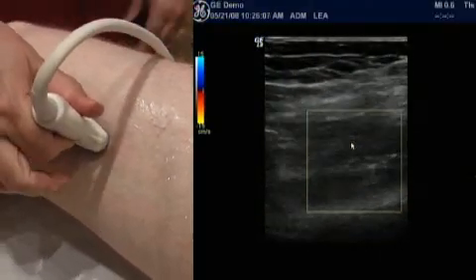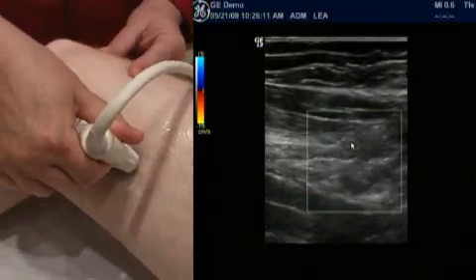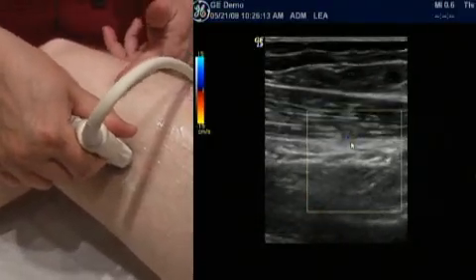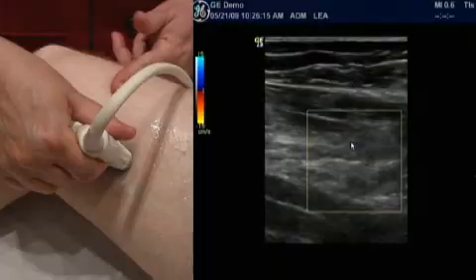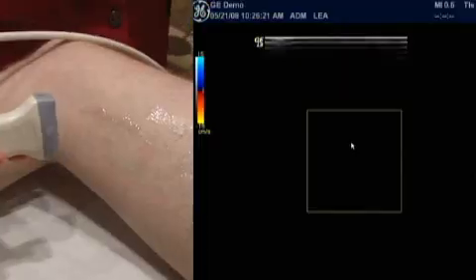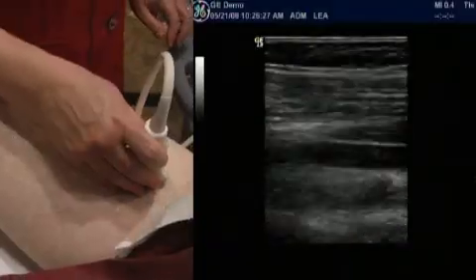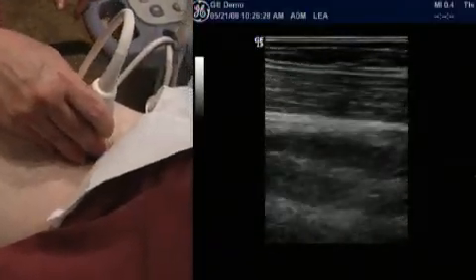If you look at where my hand is in relation to the knee joint, I'm really just about at the adductor canal. At about this point, that artery and vein are going to pass through the muscle and come up behind the knee. So we've really scanned the superficial femoral artery for the extent that we'd want to, and you'd want to come back and record some velocities.